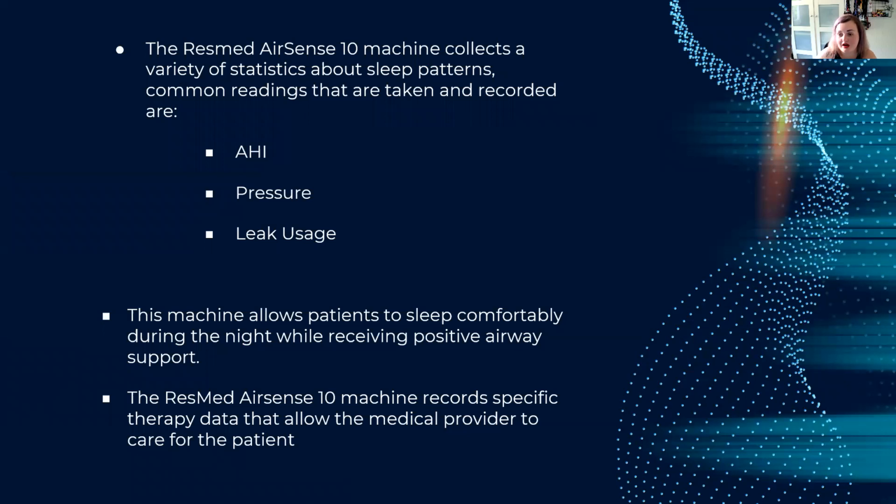Now, how they monitor whether a patient is using the device is that they record specific statistics that get sent away to the doctor. So this device has the capability to send data out and be connected to a network. It depends on the geographical location. In South Africa, this is not very much used, where the data doesn't get sent to the doctor.